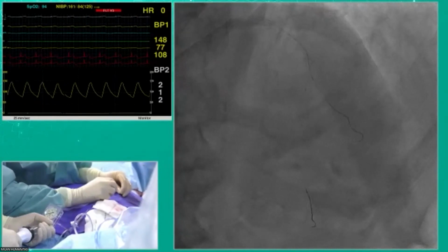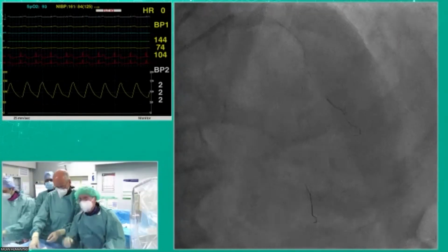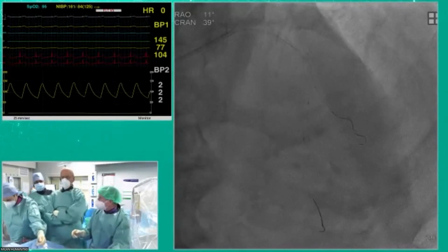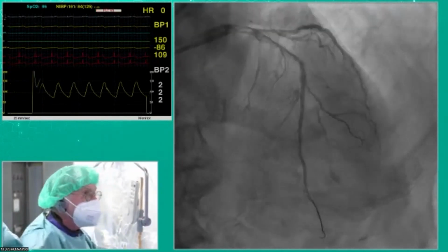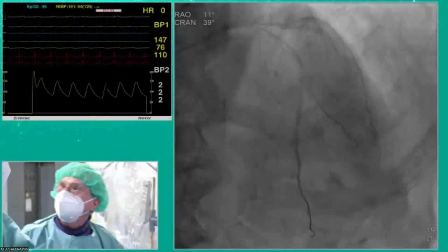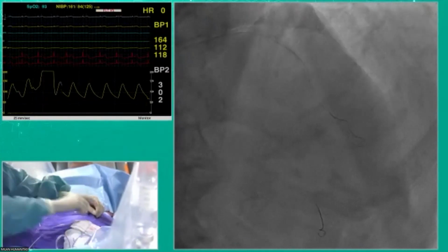You know what I used to do in the old time, when I didn't have IVUS, and IVUS was very expensive. I used to leave the balloon there and take an angio. If I see a good flow distally, means that I have a good residual lumen. This is a very poor man approach, but very good.